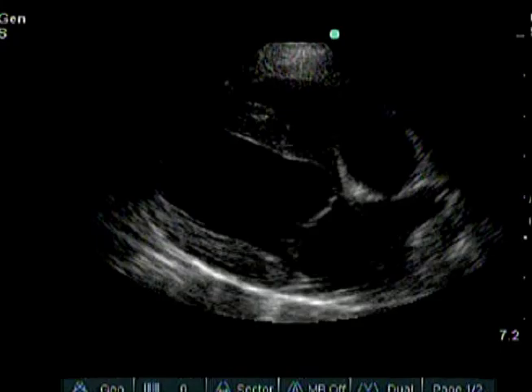Pulmonary veins can be seen entering the left atrium in the right side long axis four-chamber view. Two veins are commonly seen entering the dorsal left atrium near the atrial septum. Two more can sometimes be seen entering the left atrium near the left atrial free wall.